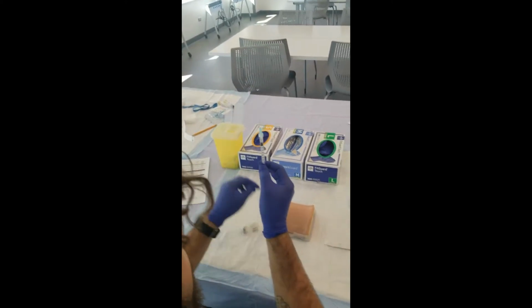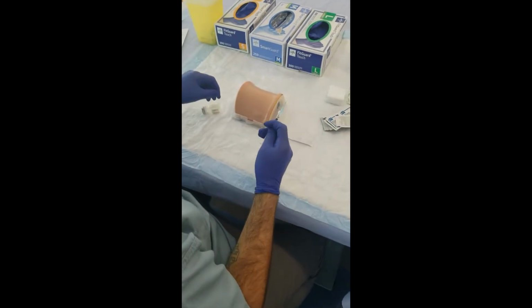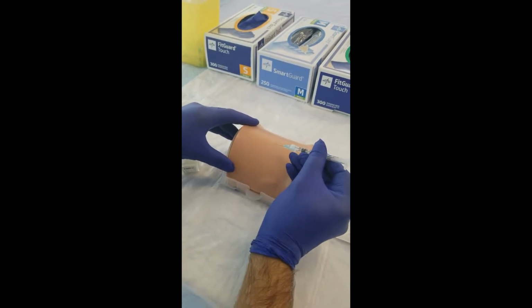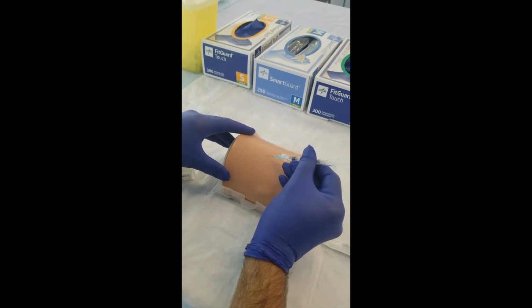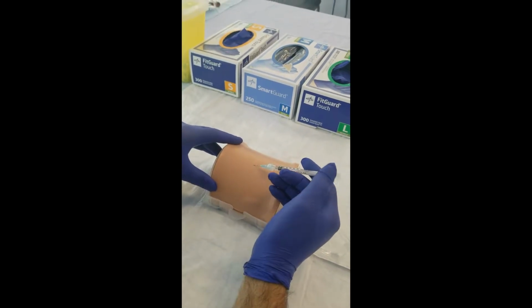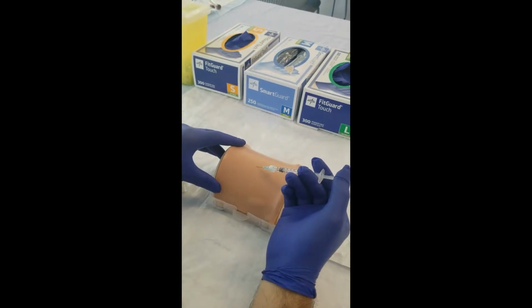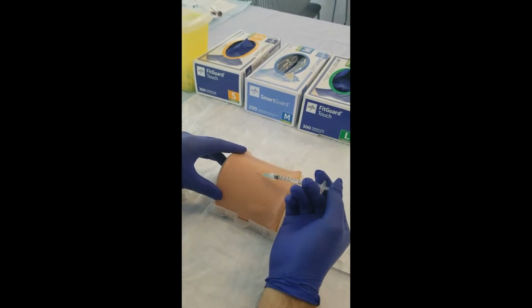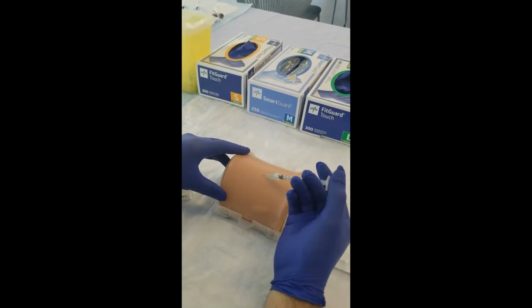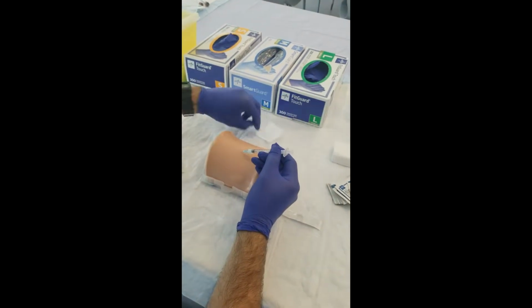Step 9, inserted needle superficially with bevel side up at a 15-degree angle. Step 10, entered just under the epidermis and injected 0.1 cc of fluid to form a bubble under the skin. Note, depending on the condition of the task trainer, a bubble may or may not form. Step 11, removed needle using a 2x2 gauze pad without applying pressure.